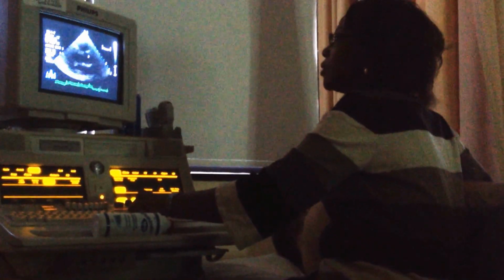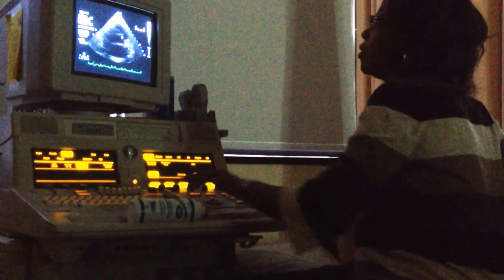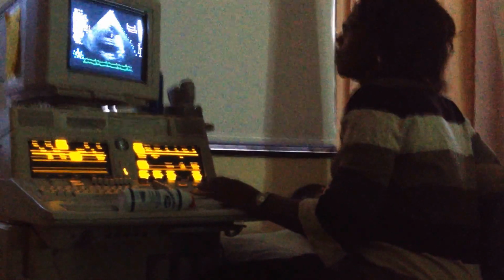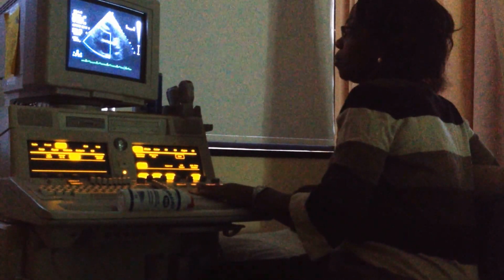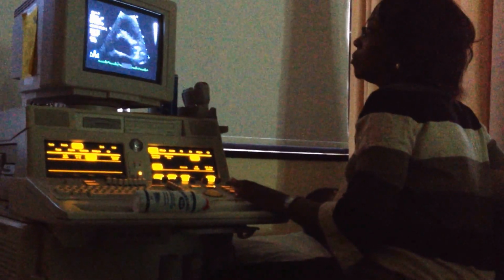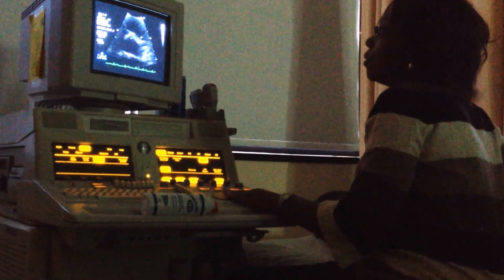Alright, so there's my parasternal long. And now I'm changing to my short. Now you can see a little bit of the cusp of the aortic, but all three of its cusps aren't that clearly coming in. And that's not abnormal. That's when we use our zoom. We can try to bring our box over, resize it, position it, use our zoom or magnify to try to bring it in. Holy moly. And now we can see our aortic valve, we can see our pulmonic valve there.